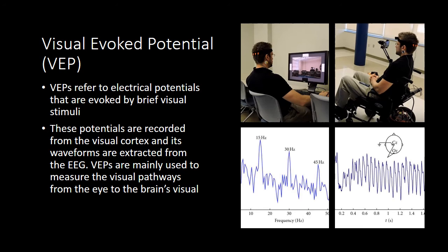Now we will discuss a few modern BCI systems. One of the implementations of the BCI system uses the visually evoked potentials. So visually evoked potential is the type of dependent BCI system because it depends upon the eye muscles movement and uses the concept of evoked potentials.